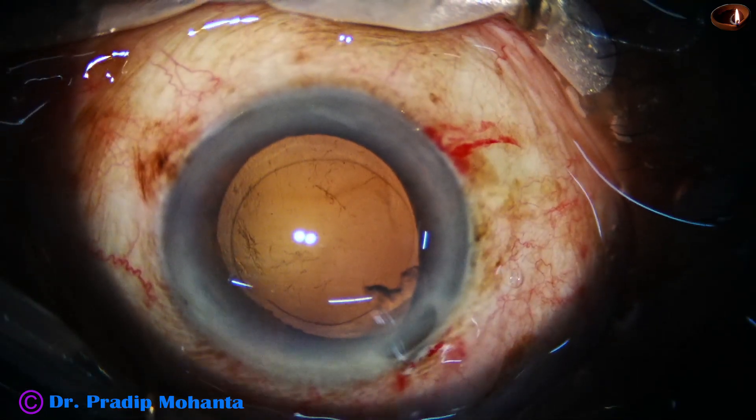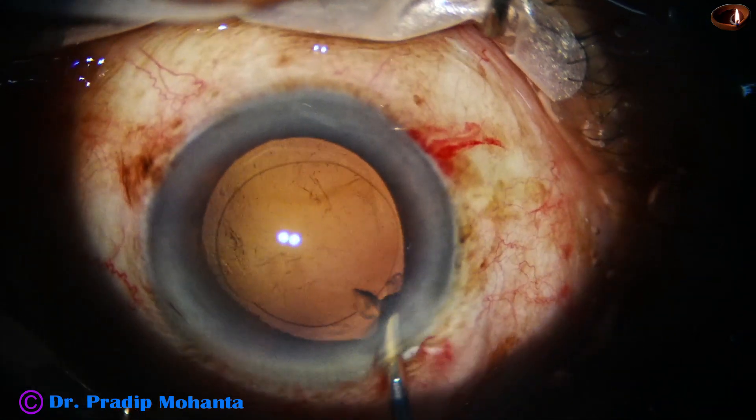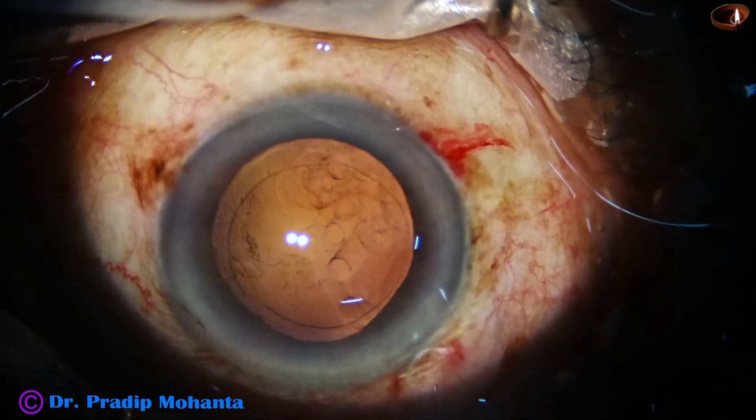There is a little bit of prolapse of the iris, so the iris may be a bit floppy.